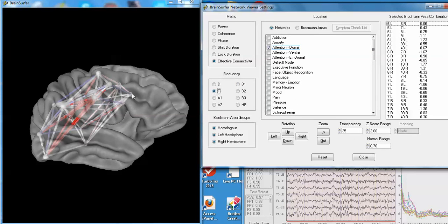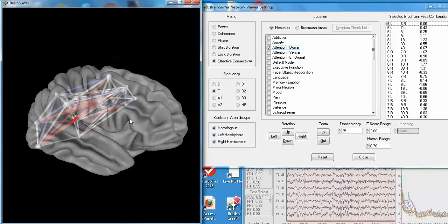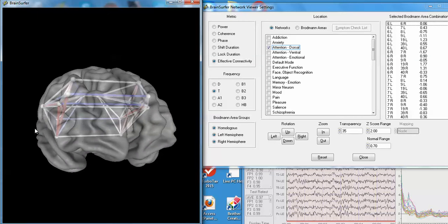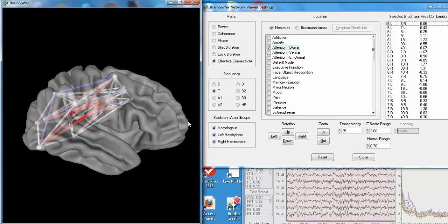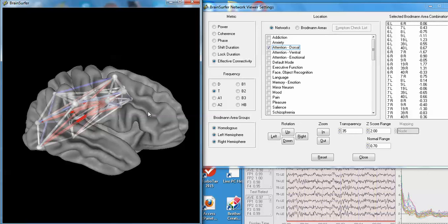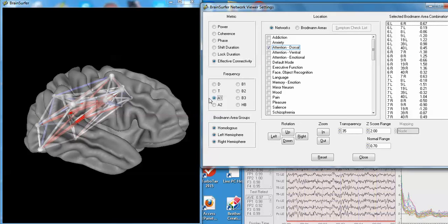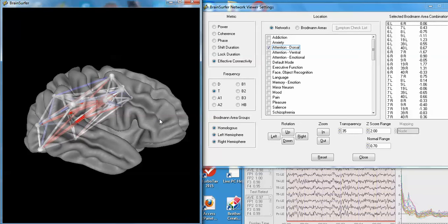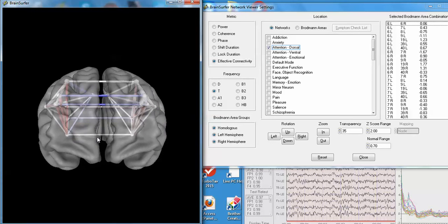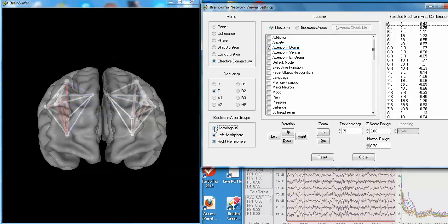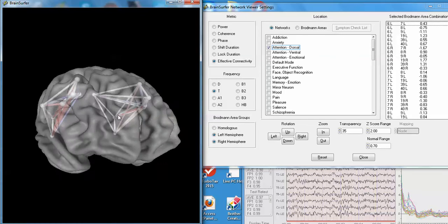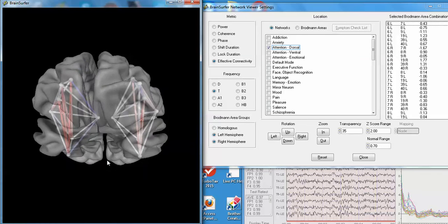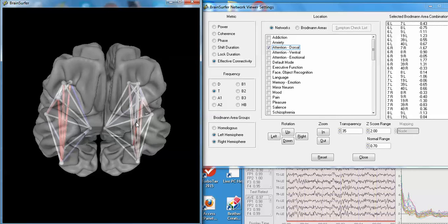I'm going to look at the theta band to look at effective connectivity in the dorsal attention network. And we can see that there's significantly deviant flow of information within that network. And we can examine that at different frequencies. I'm going to now eliminate the homologous, so you can see just the left and right hemisphere for the dorsal attention network.